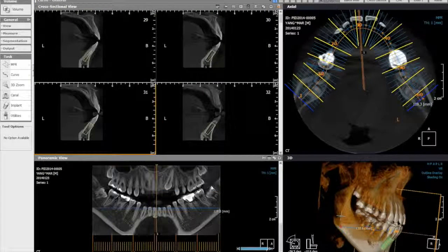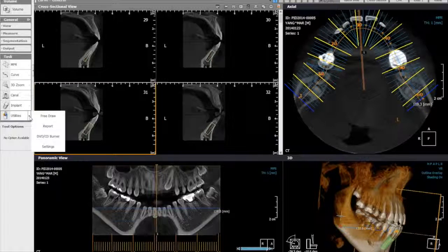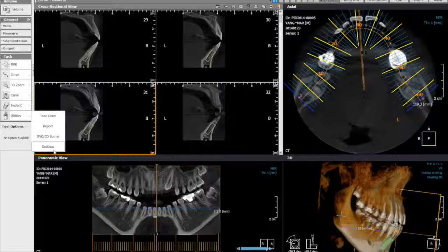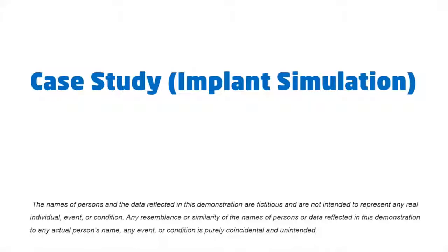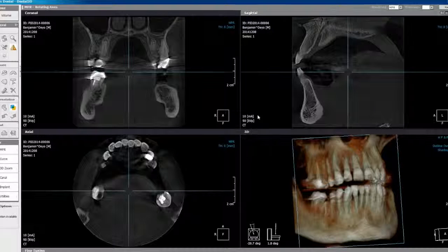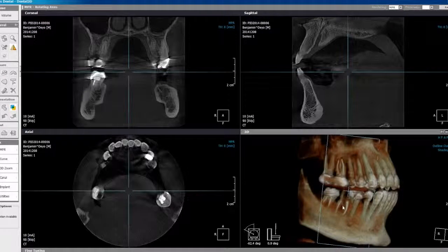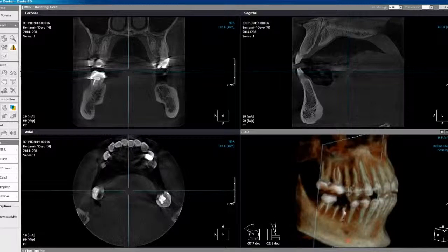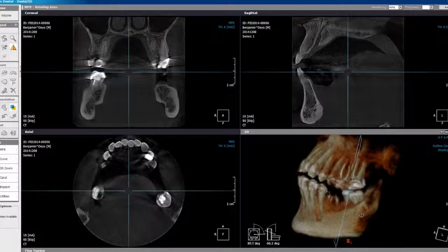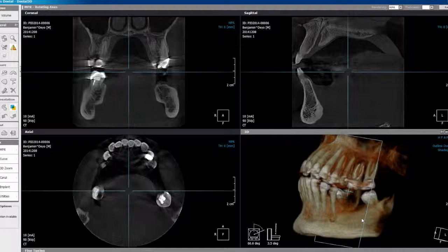If you would like to share the image, you can go to Utilities. You have the ability to create a report and add different captured screenshots. You can also burn the image as well as a fully functional viewer from the Jella software to a CD along with the patient's image. The names of persons and data reflected in this demonstration are fictitious and are not intended to represent any real individual, event, or condition.